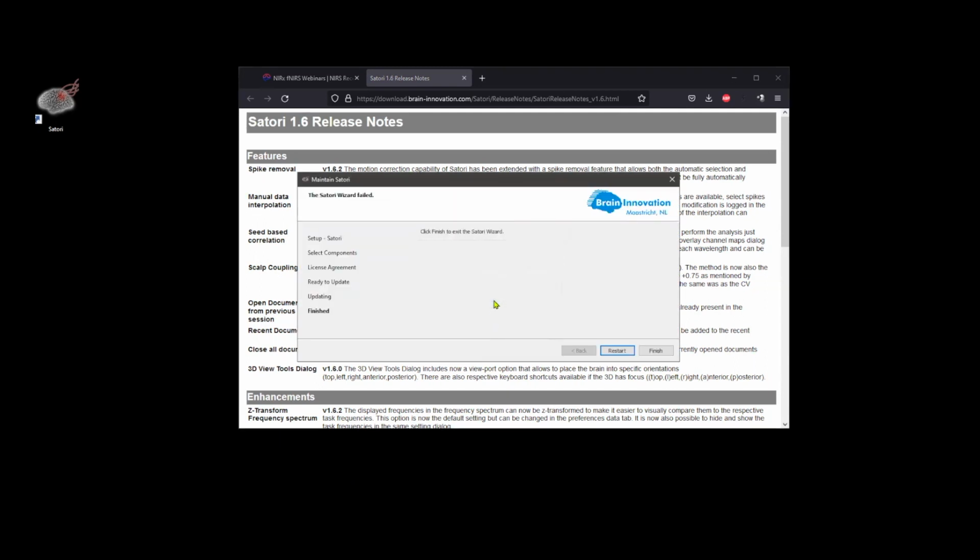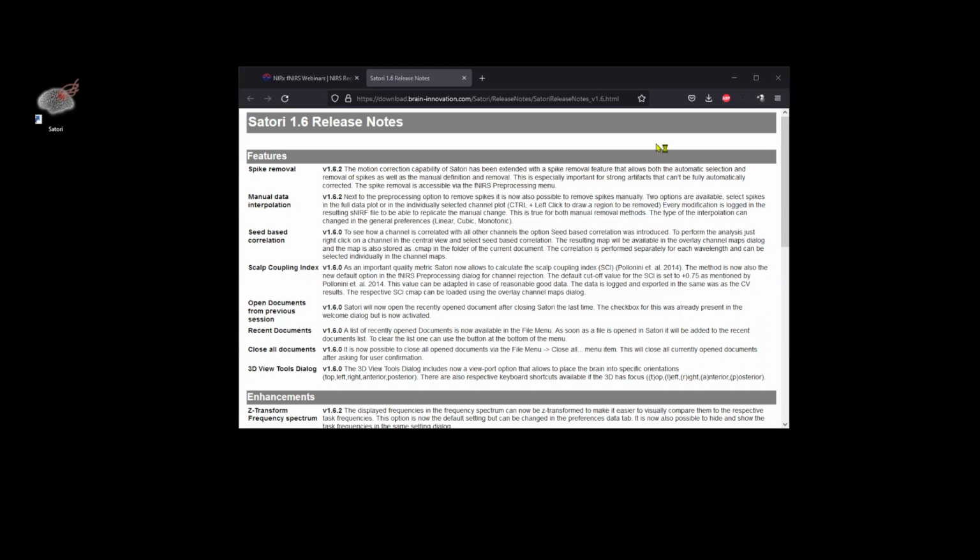Okay. So just assume we have updated the application, and as soon as we start Satori again, we get the current updated version of the software.